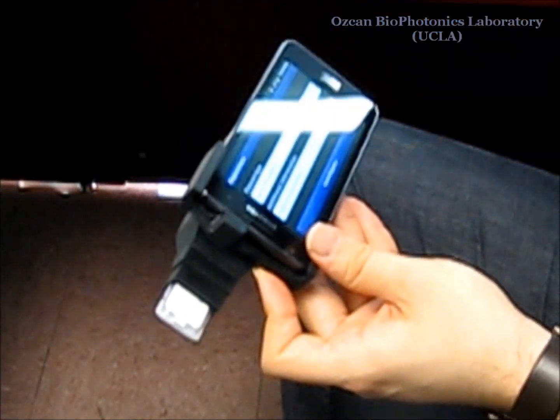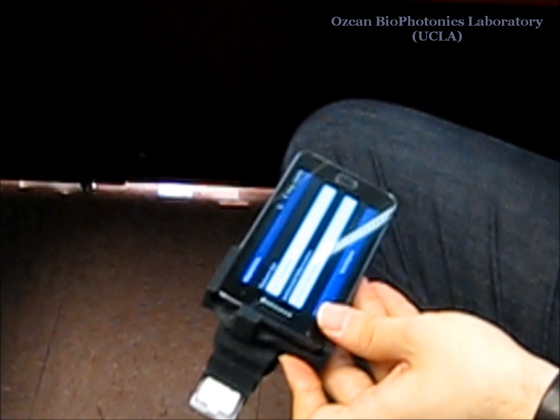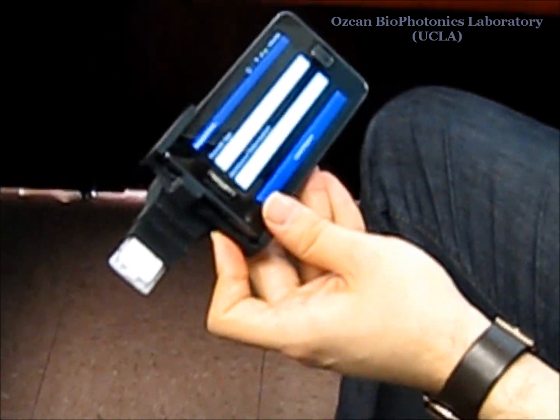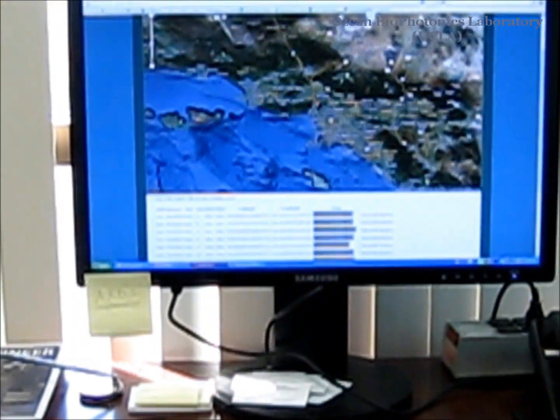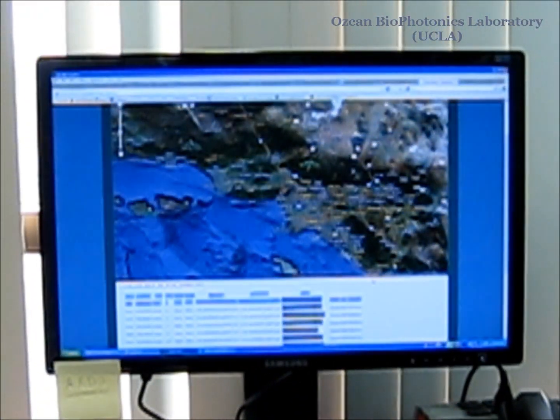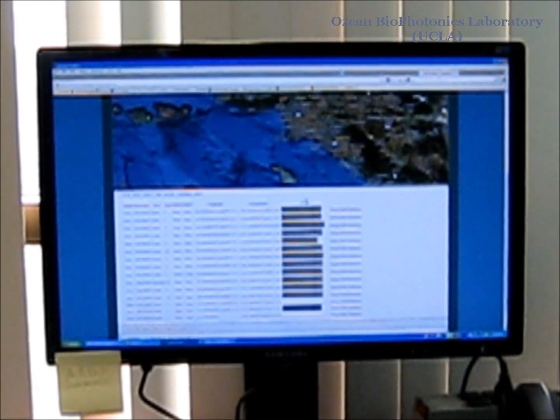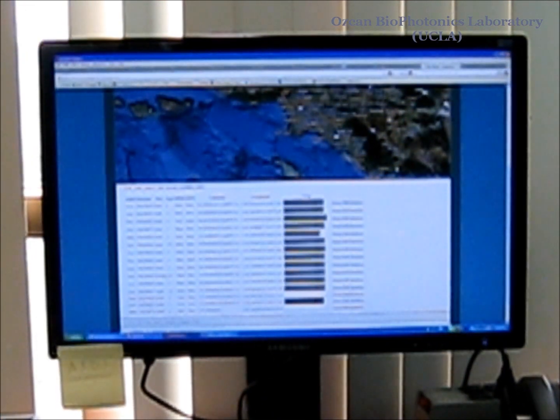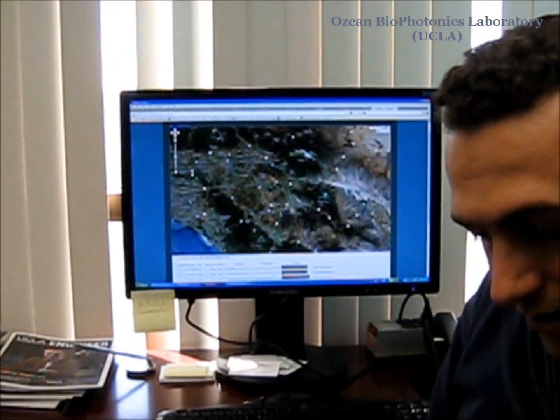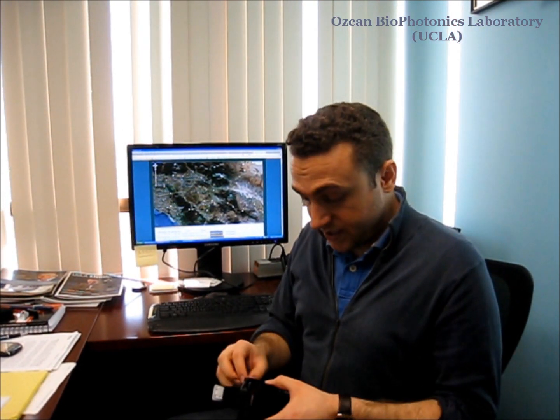Once uploaded through Wi-Fi, everything will be shown on Google Maps with the raw data including the images and the patient information. This allows us to visualize in a smarter way the diagnosis of infectious diseases across a village or even a continent.